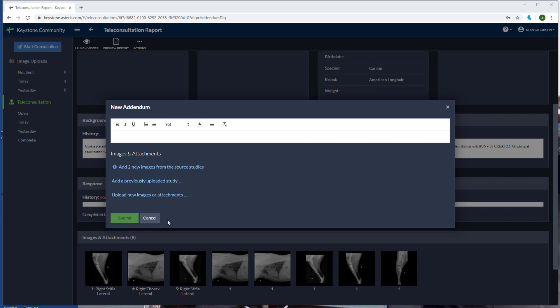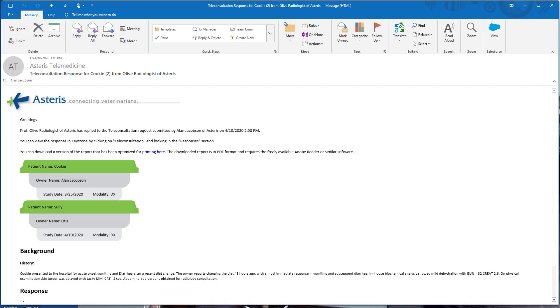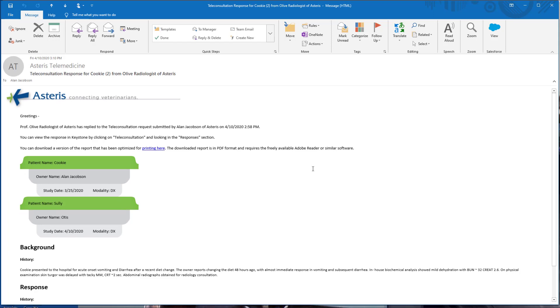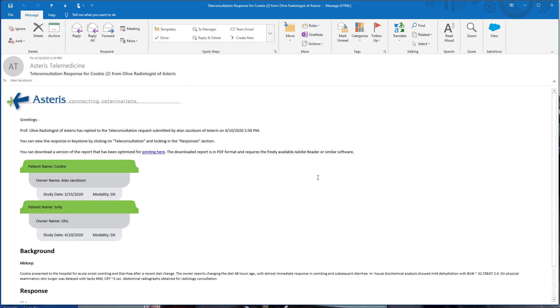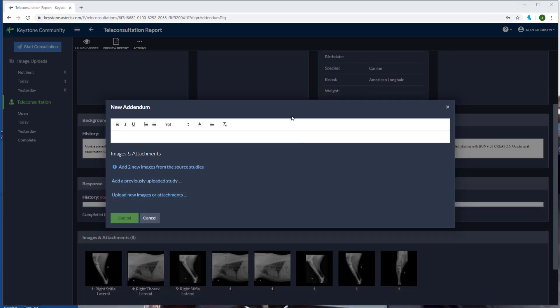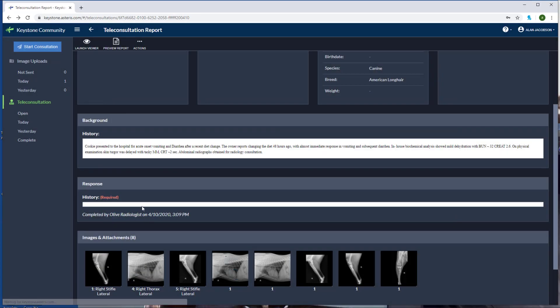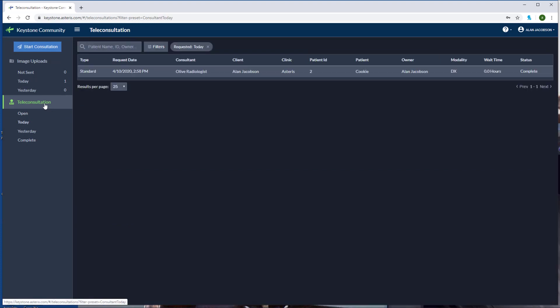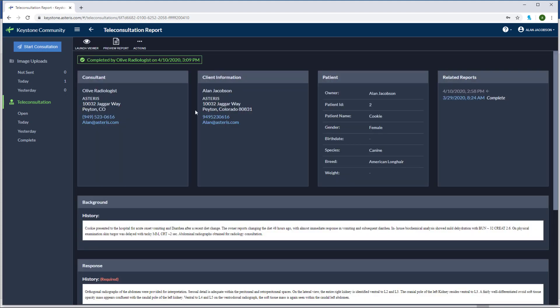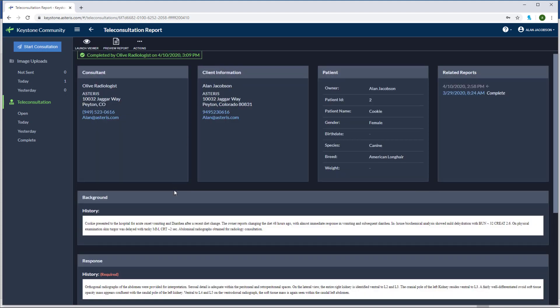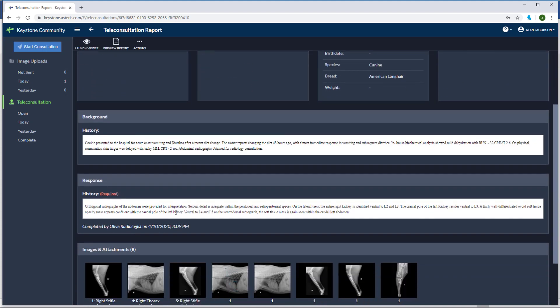Once the specialist responds to your request, you will receive an email as you can see here. The response will have the history and the report from the consultant. We can also access the report from the teleconsultation tab in Keystone Community. You can see the status is complete. Now we can click on the report. We can see the response from the consultant.